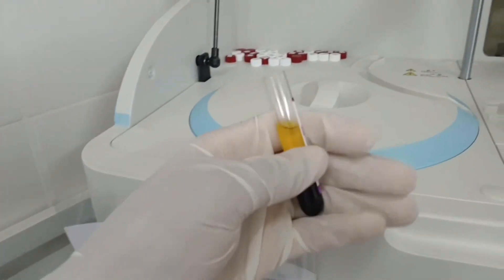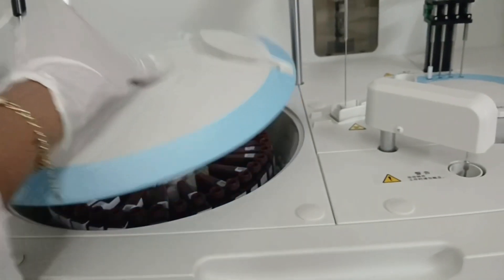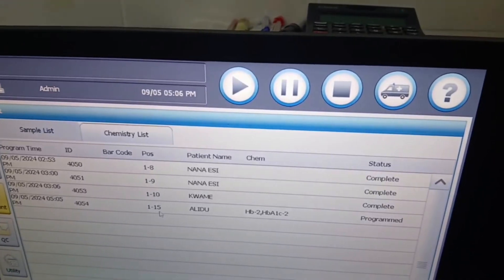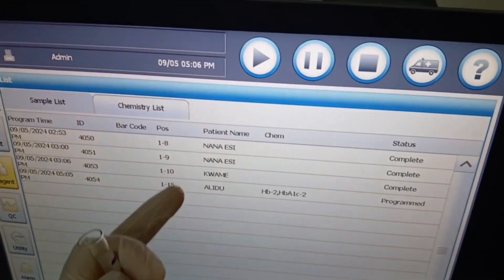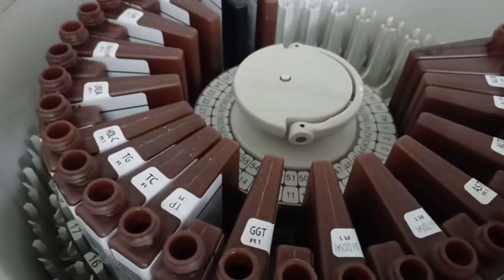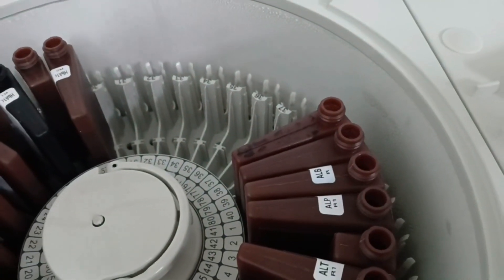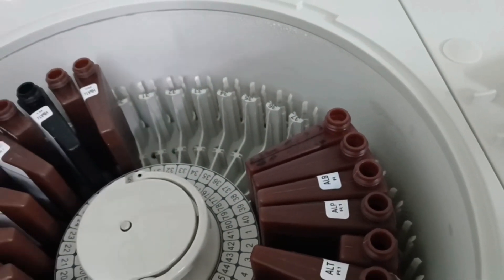We will uncap it and introduce the sample to our machine. Alidu is position number 15, so we will put the Alidu sample at position number 15. I hope you can see position number 15.